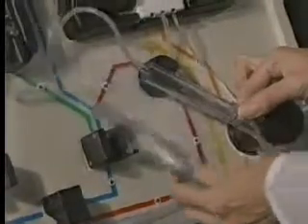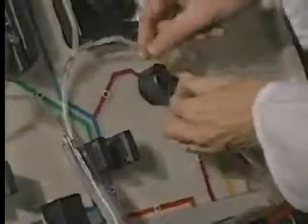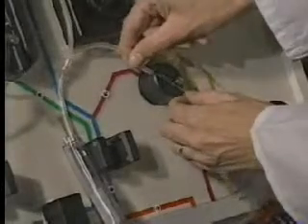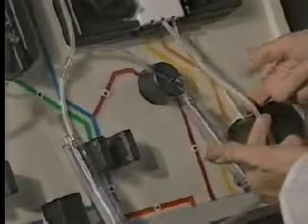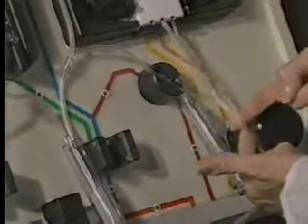Use a flossing action to place the RBC line into the RBC line valve and detector. Rest the RBC reservoir on the front panel. Ensure that the line going to the plasma pump is not loaded in the RBC valve. You are now finished with the right side of the machine and are now moving toward the left.